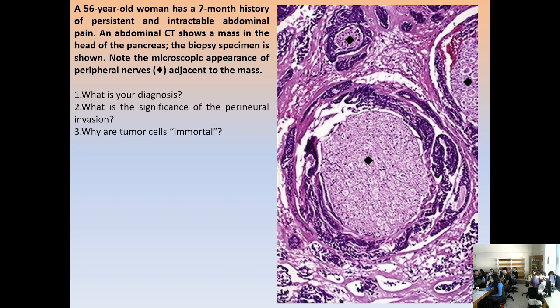How do malignant cells look? As a rule, they have nuclear pleomorphism, and the nuclei are big, different in shape from one cell to the other. So malignant tissue stains dark. Why? Because the nucleus is big. So we have hematoxylin staining, not eosin. This is a rule with exceptions, of course, but here all you see as dark staining cells are cancerous cells. So who can show me, please, where the cancerous cells are.